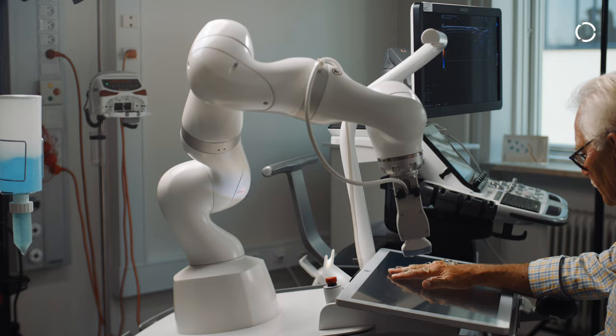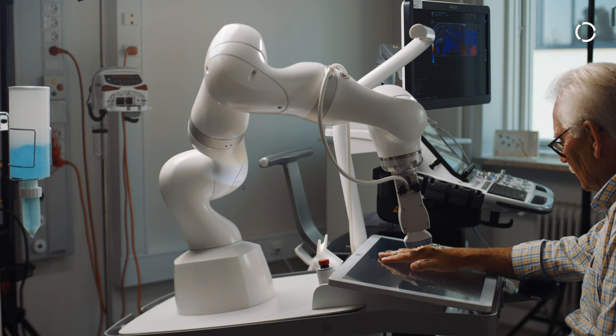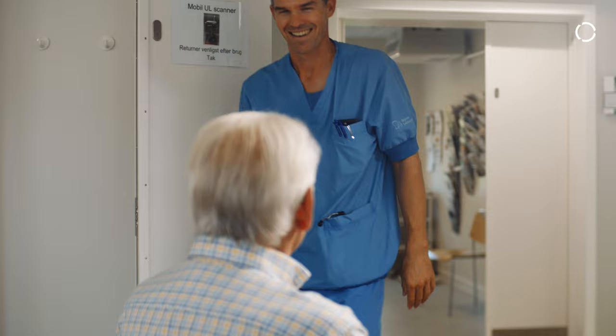It takes a lot of time to train a specialist to do these musculoskeletal ultrasound scans, so the main advantage for patients is that they can get the scan. The robot can keep learning and will be a very reliable part of the staff to perform high-level diagnostic ultrasound on our patients.